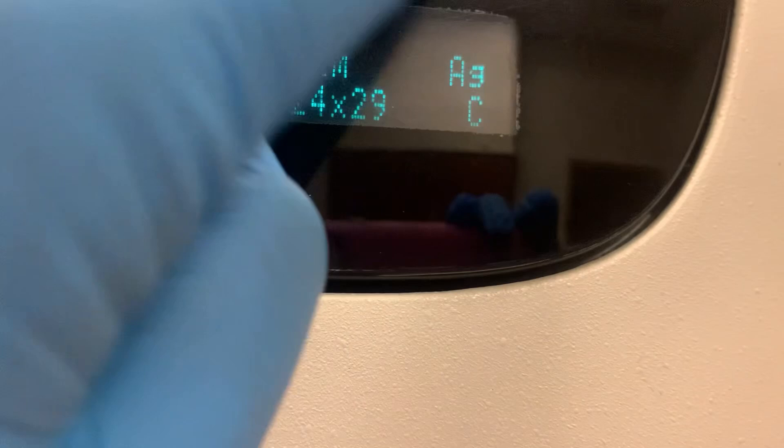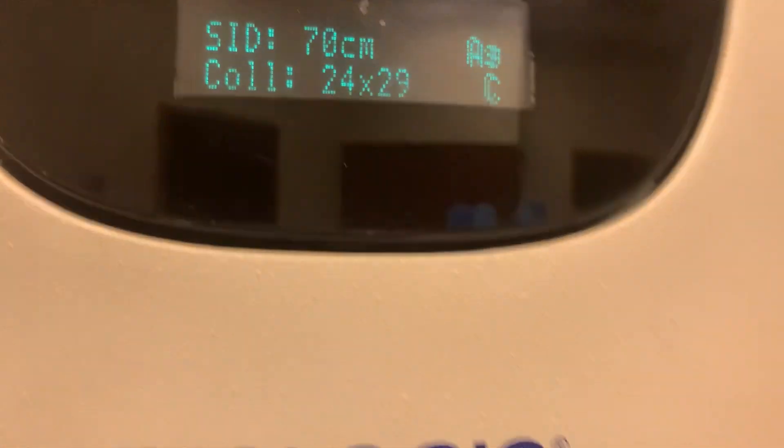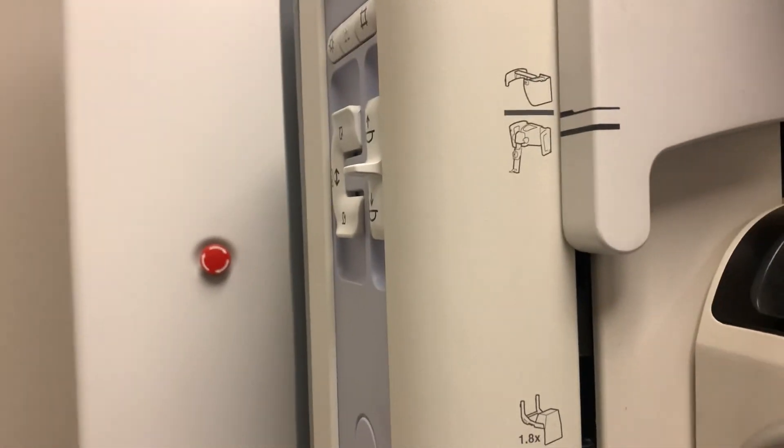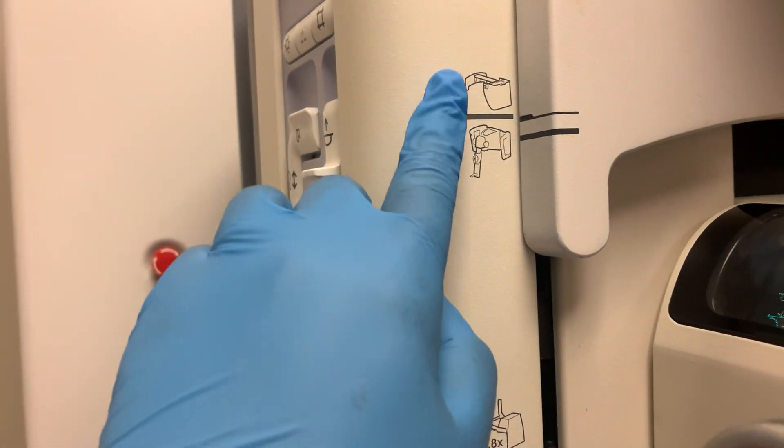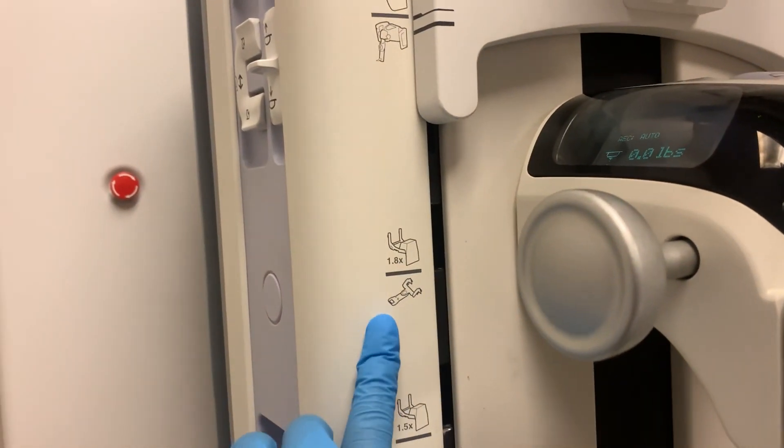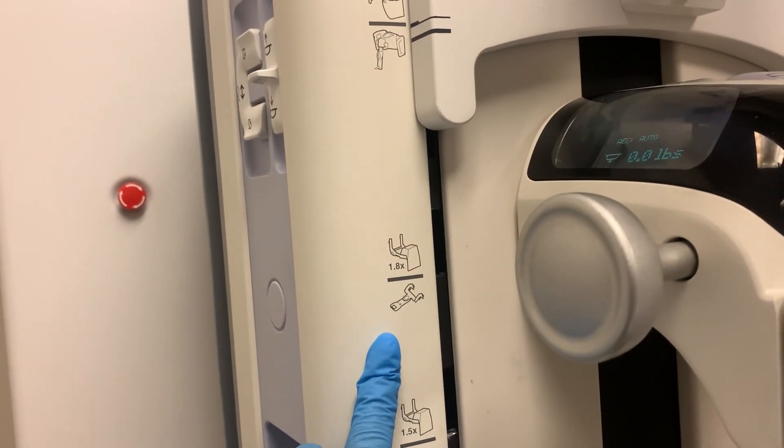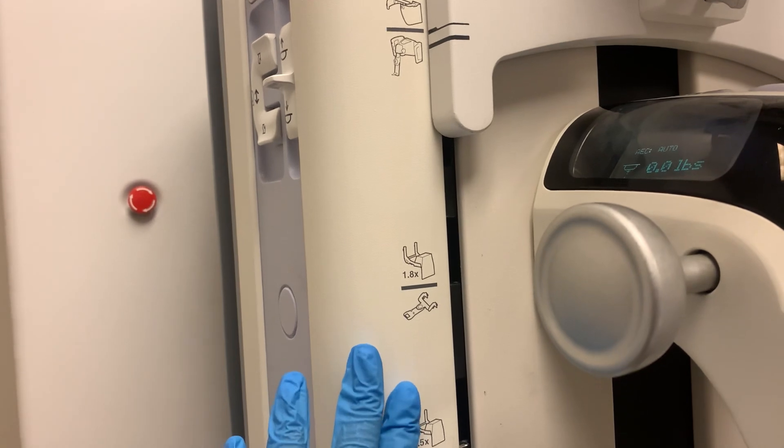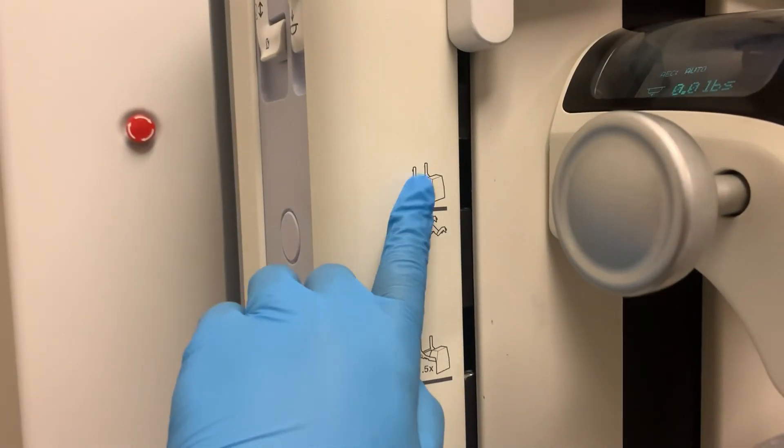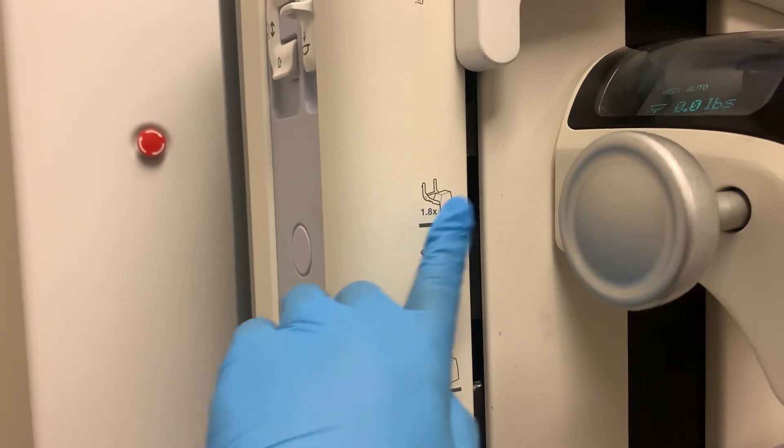This one is at 70 centimeters. And then this filter, AG, is silver. And then it also shows what compression paddle you have. Right here, 24 by 29. And then you also have little pictures right here. It shows that the face shield goes right here. If a patient has to come back for a diagnostic mammogram and have to use the calcification paddle, then the calcification magnification stand will fit right here.